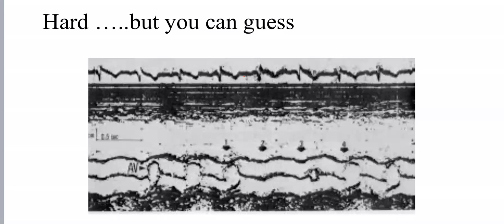The very first thing that jumps to your mind is that I may have a pause or something like that. So I look at the ECG and the ECG is fine. At the time when I don't have a mechanical effect of a beat, I have a normal ECG. With a normal ECG you expect that with each beat you have an open aortic valve. Now I have a normal ECG all through, but sometimes I miss the aortic valve in M mode. It's closed during this time, or there's a small opening of the aortic valve, like the beat in the middle.